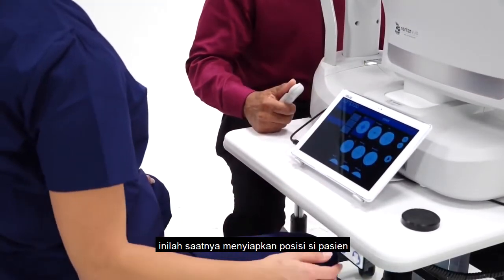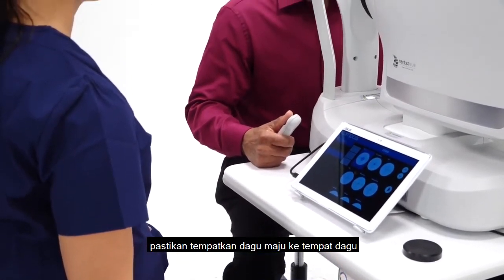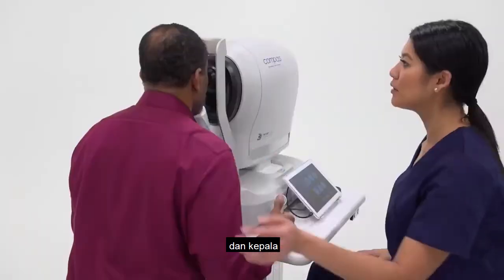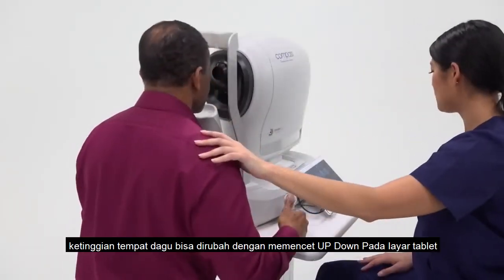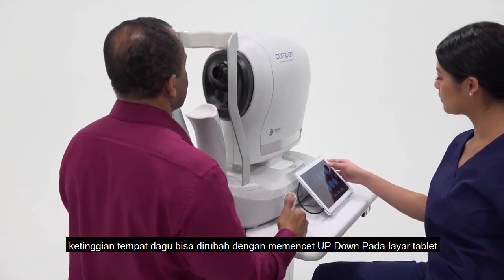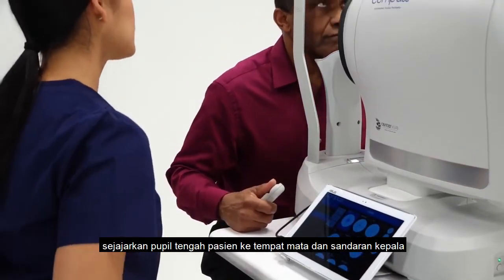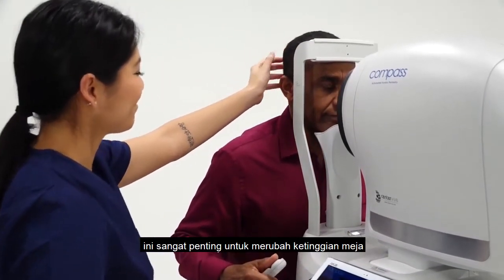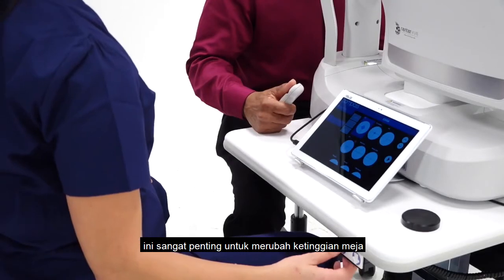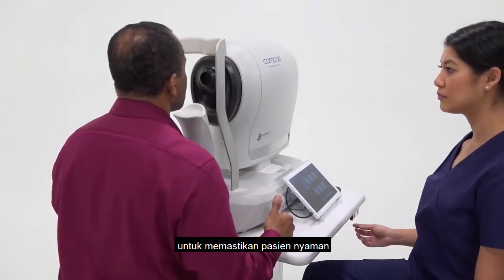It is now time to properly position the patient. Be sure to place their chin forward in the chin rest and their forehead all the way forward into the headrest. The chin rest height is adjusted using the up-down buttons on the tablet. Align the center of the patient's pupil to the etching in the headrest. It is important to adjust both the table height and possibly the chair height if necessary to ensure patient comfort.